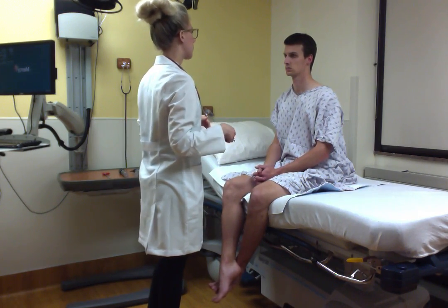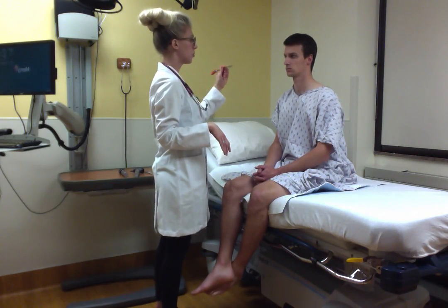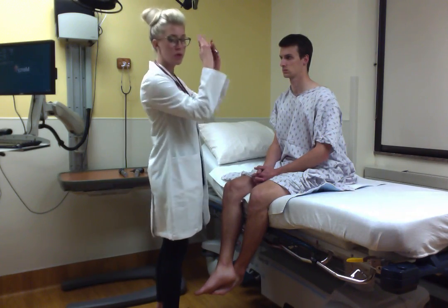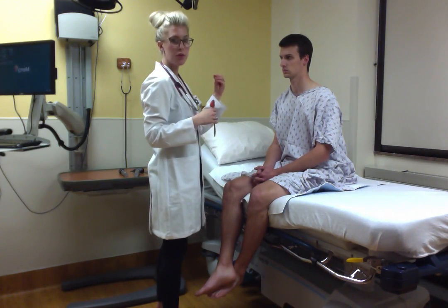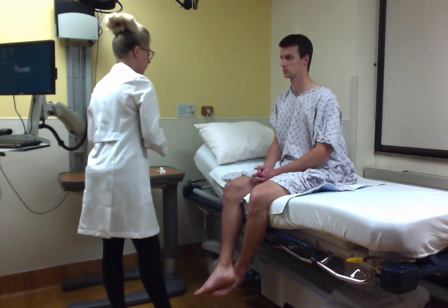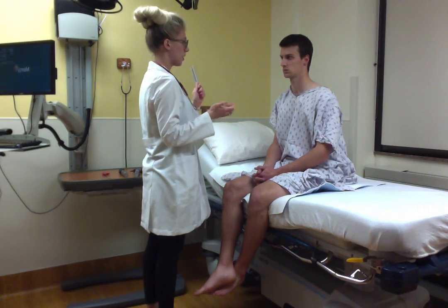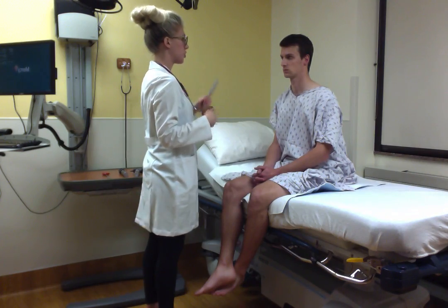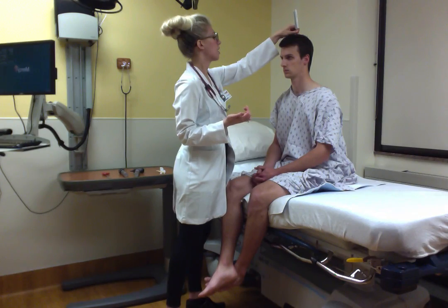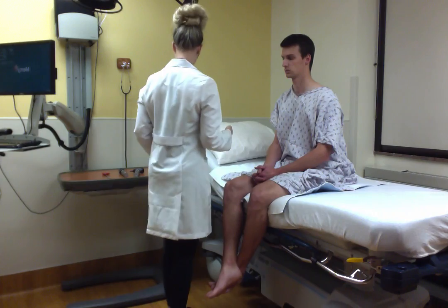And then the trigeminal, we checked with the sensation of the face, and the facial with the symmetry of those movements. They were all symmetrical. Next, we are going to do the vestibulocochlear. First I'm going to place this on your head, and you're going to tell me which side you hear this in. Okay. Both. Both. Good. Midline is the correct response with that, normal response.